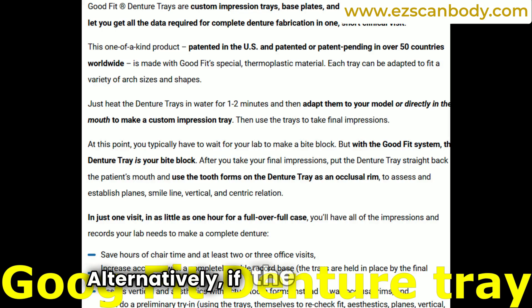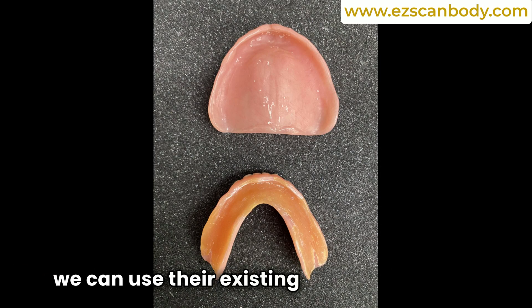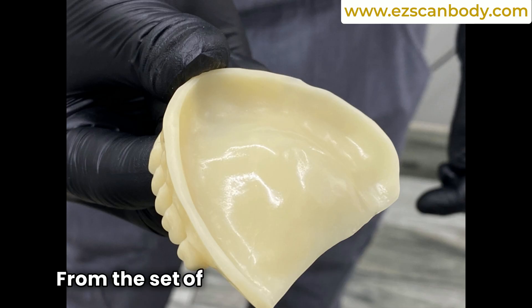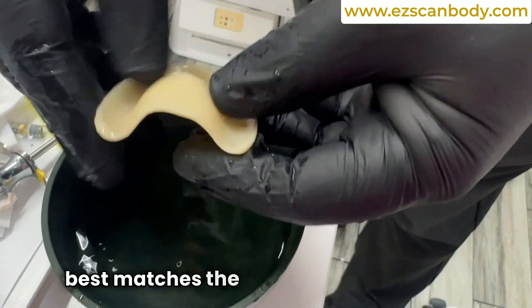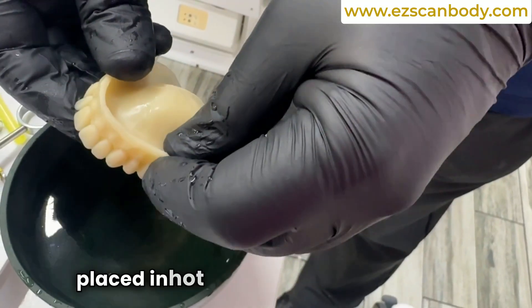Alternatively, if the patient was previously edentulous, we can use their existing denture. From the set of four good-fit trays, we select the one that best matches the patient's jaw.